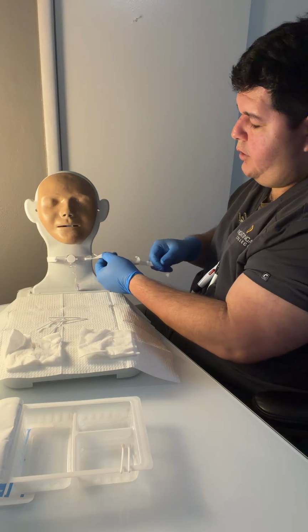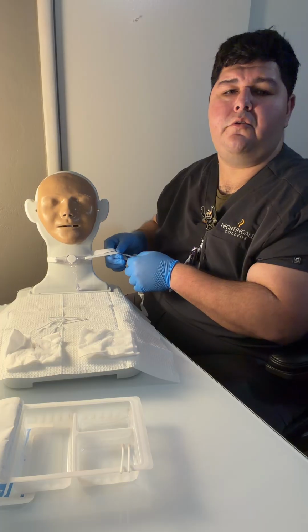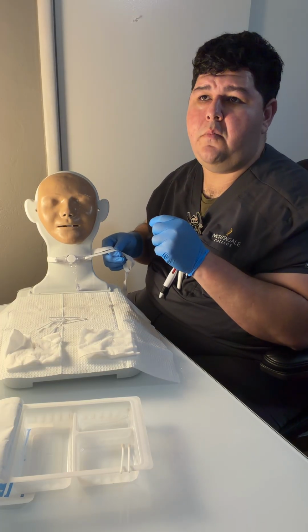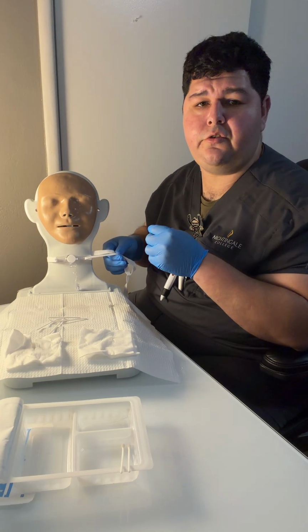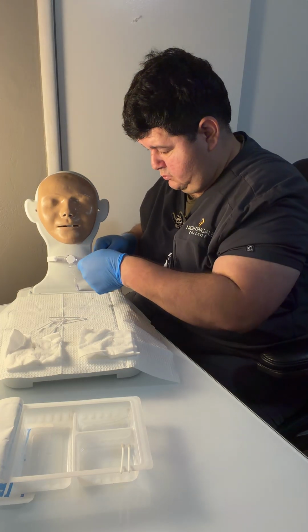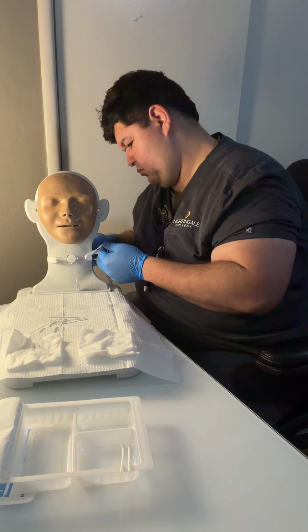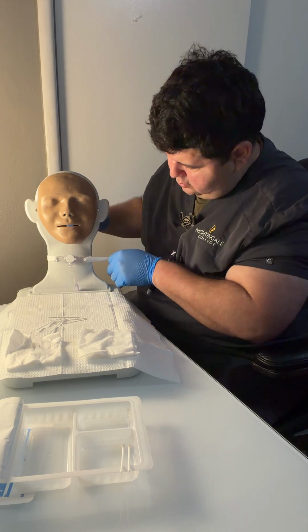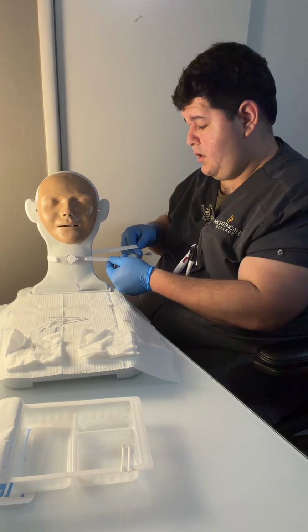At this point, before I do my tie, I want to come around the back and ensure there's no twist on the tie itself, no twist or anything that can cause skin irritation or skin breakdown. I want to make sure it's on securely. And then I will tie the knot.